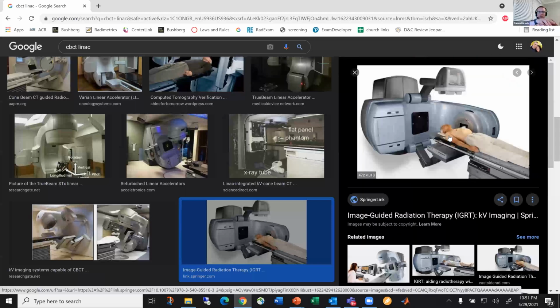In a normal CT scanner, the field of view is large enough, it's 50 centimeters. We can do one full spin and get a full 50 centimeter field of view. In these systems, the field of view is smaller. So if you're doing, say, liver imaging, you'll center the rotation over the liver. The patient is shifted and you spin around. So you don't get the whole abdomen, you only get the liver. But because it's offset, you also get a lot of artifacting.